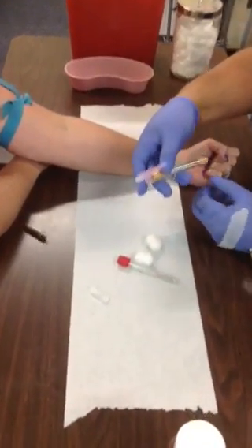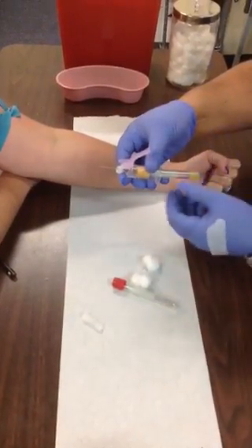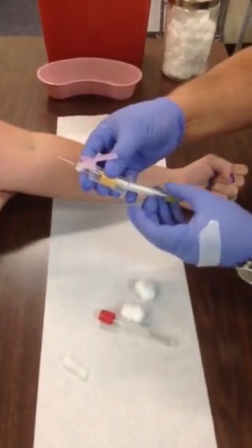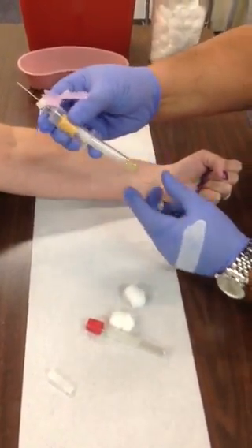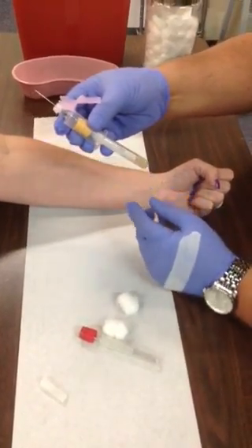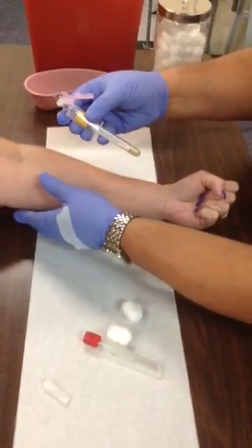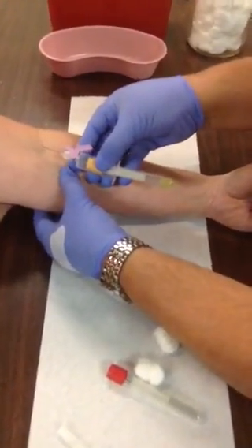Remember not to touch the needle. The bevel of the needle has to be facing up. Notice how I'm holding the adapter with three fingers and a thumb, but using my pinky to steady the tube so it doesn't fall out — pressing the tube up against the inside wall of the adapter. Go ahead and pull the skin tight, and approach the vein the way an airplane approaches a runway.